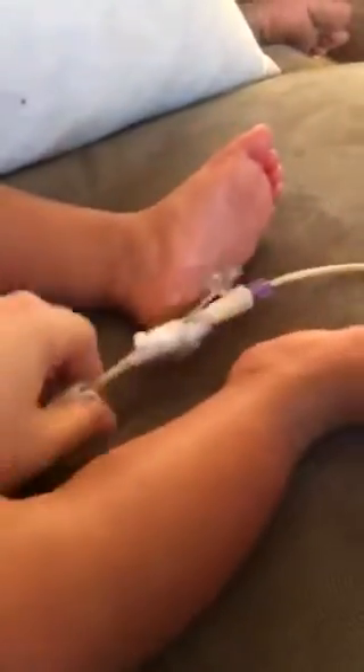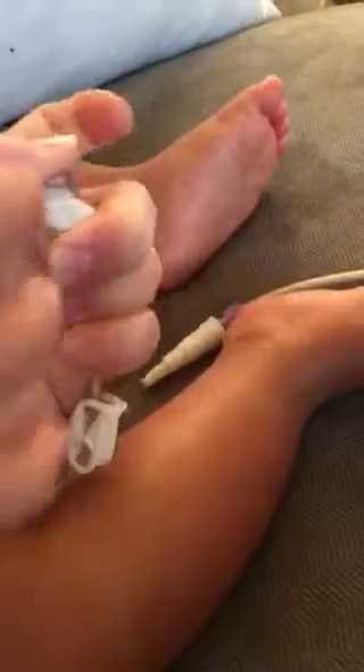Okay, it's saying no flow on the new machine. So what you do is you clamp it, take it out, snap it.